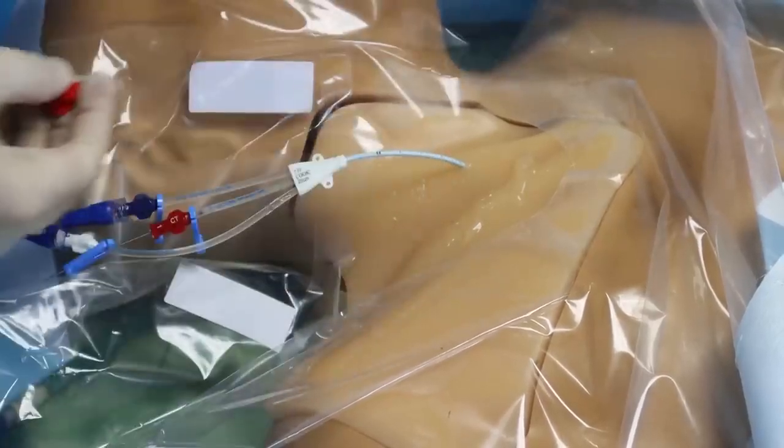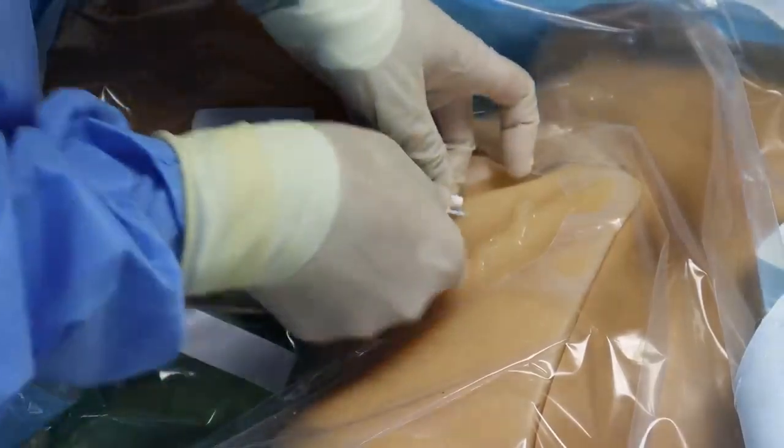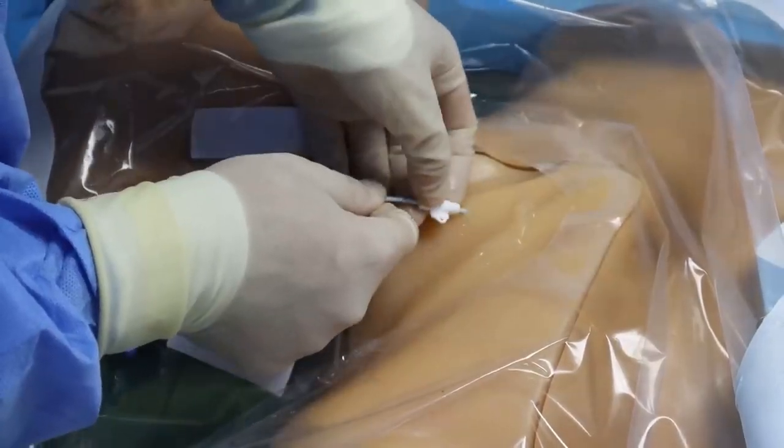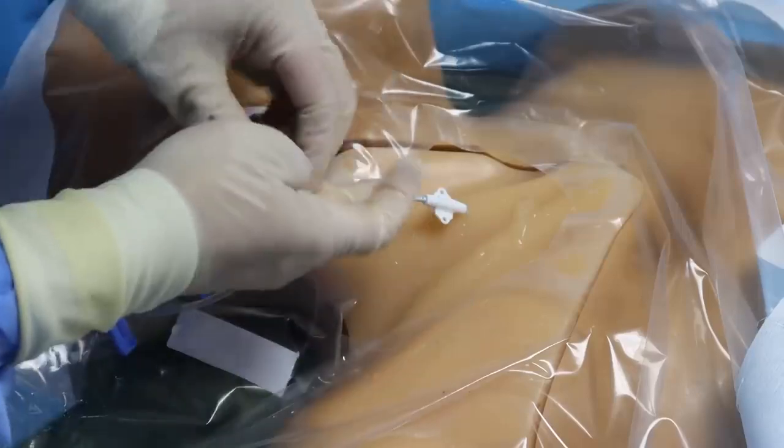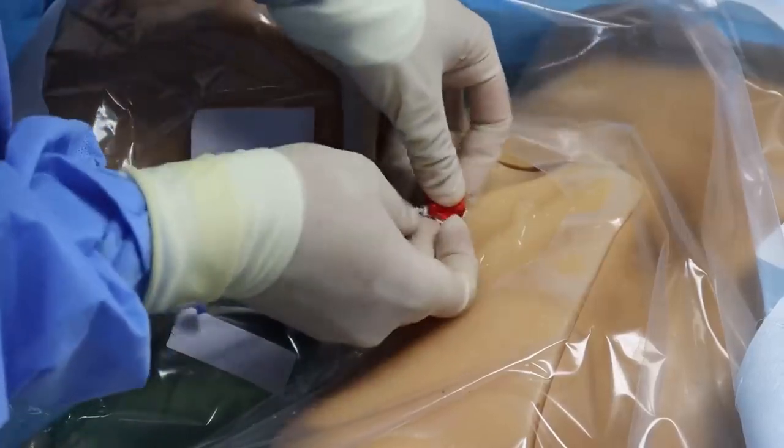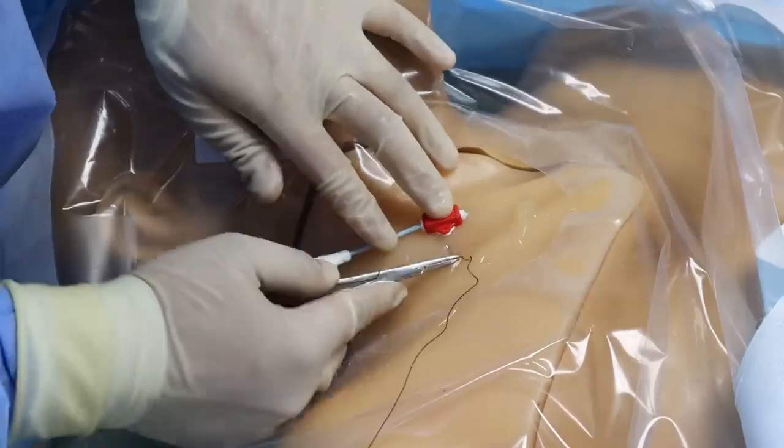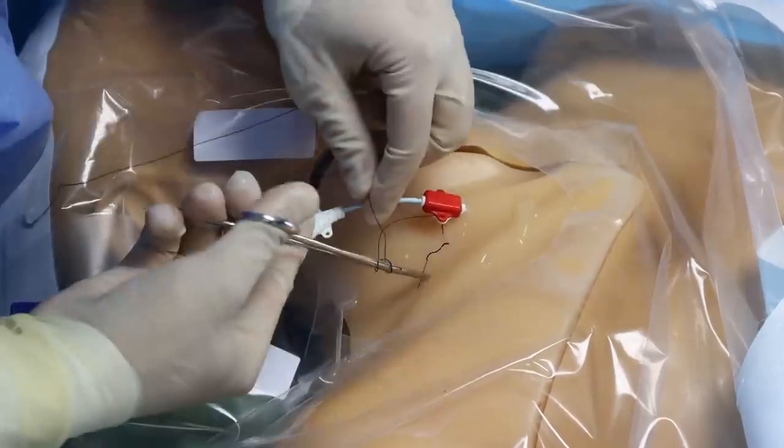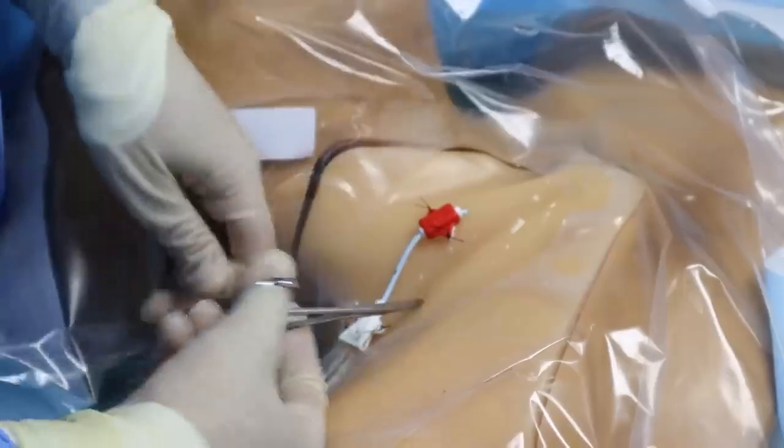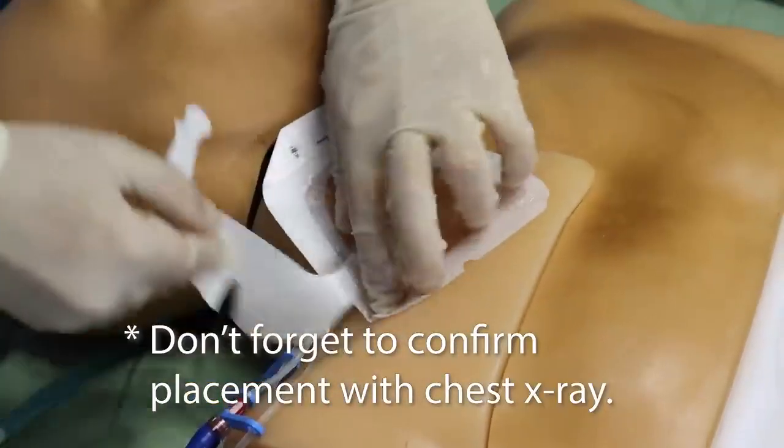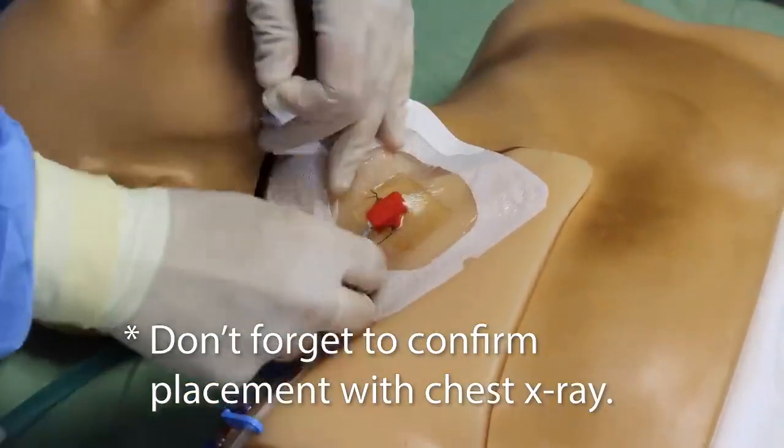All that's left is to suture this thing in place, so confirm the catheter depth is correct. Then take the white soft part of the catheter fastener and affix it around the catheter, right up against the skin. Lock the white part in place by snapping the hard red part of the fastener over it. Sew this in and then sew in the fixed white holes as well. Put the sterile dressing on, call for x-ray to confirm placement, and call it a job well done. Doesn't stick to the mannequin very well.